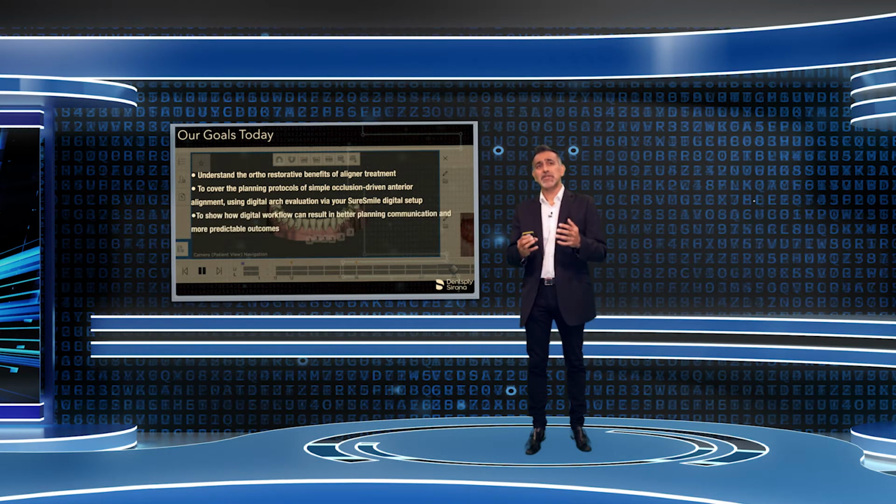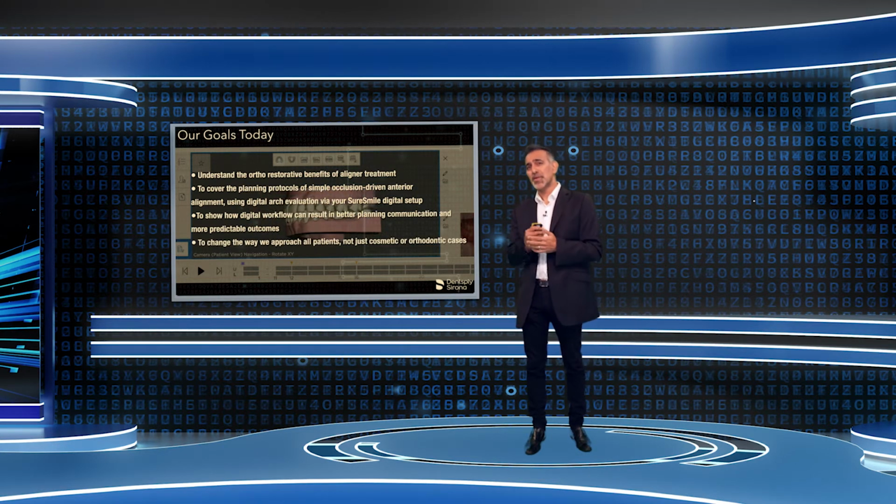I'm going to show you how the digital workflow can result in better planning, communication, and more predictable outcomes. So you make sure the teeth end up in the positions that you planned from the beginning and towards the end without any issues. And this hopefully is going to change the way we approach all patients, not just cosmetic or orthodontic ones. And these are patients sat in your chair every single day.